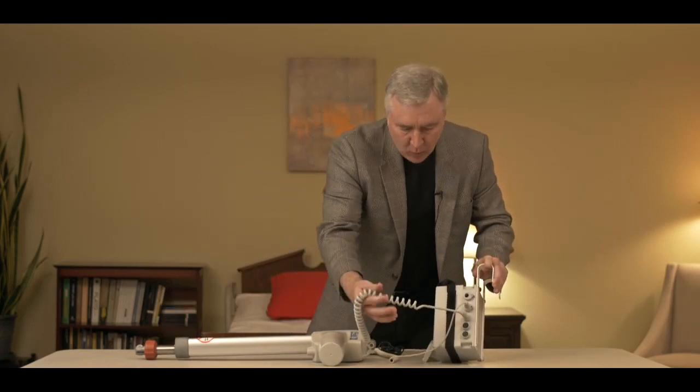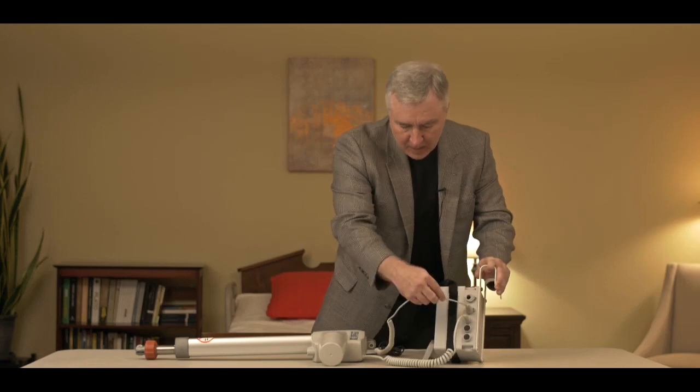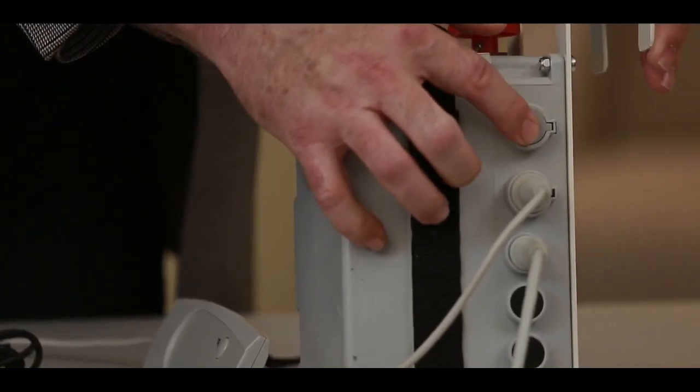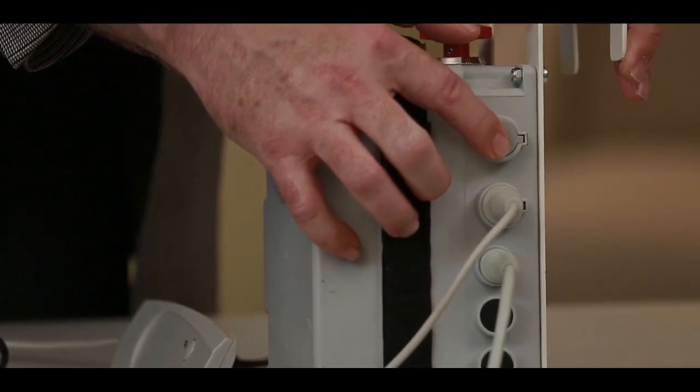With the Style 1 electronics you can see here that we have the actuator plugged into one spot, the hand control plugged into the spot right above it, and right above that is the charging port that will actually charge the batteries.